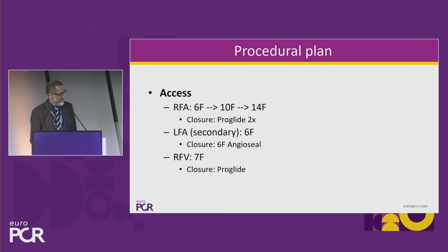I give local anesthetic, and the calibration of sedation up and down for us is not the nurse, it's the anaesthetist. And the anaesthetist I'm very friendly with. There are some hospitals who can't find an anaesthetist. That's not the situation with us.